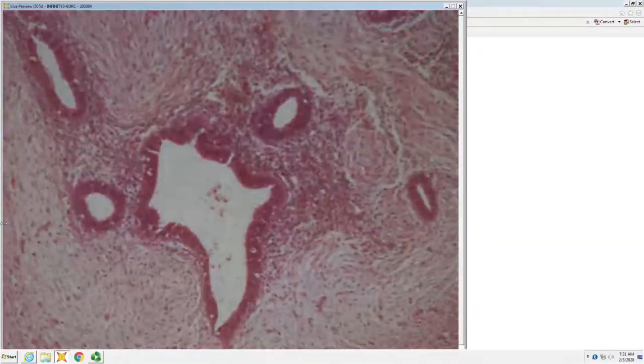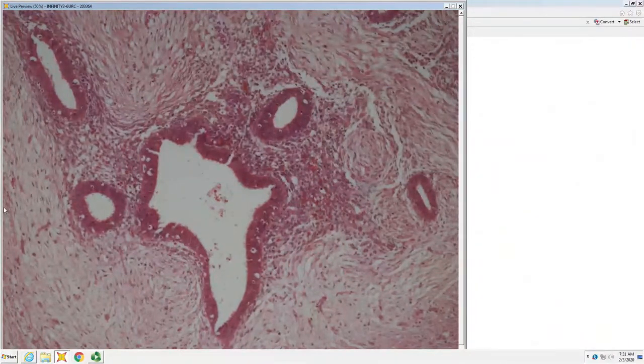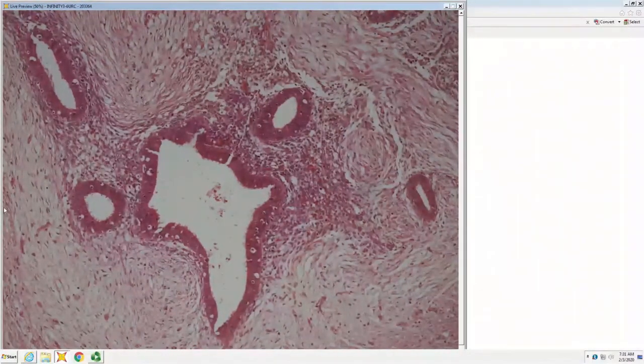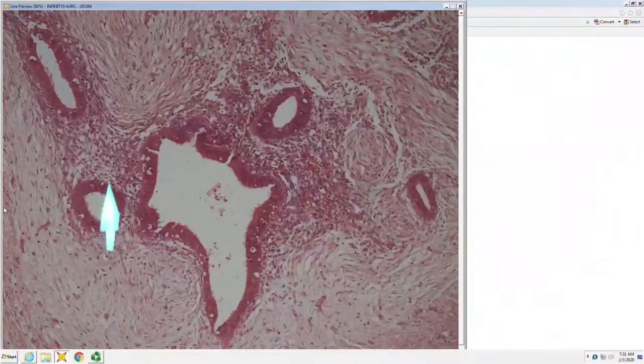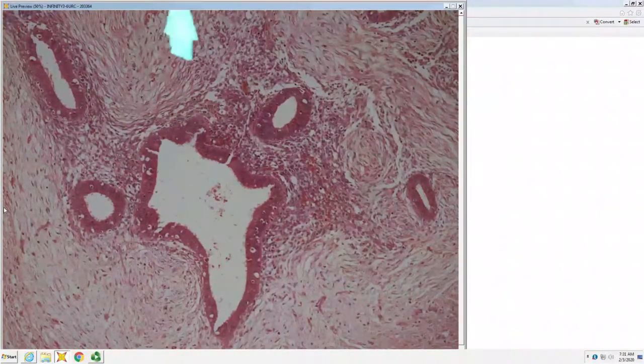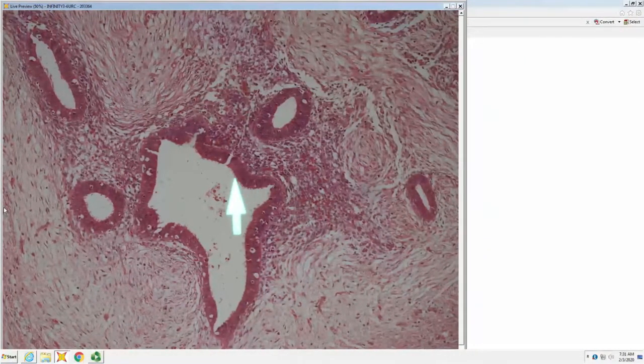Mark, what do you see here? I'm getting probably lymphatic. There's like a thickened wall, whatever we're looking at, with definitely some inflammation around it, some lymphocytes, some extravasated blood cells, so maybe it's vascular sites we're looking at. So not necessarily in the lymphatic. There's definitely stroma around it, fibromyxoid. There are plump mesenchymal cells in the stroma. There's red cell extravasation in the stroma. A columnar epithelium that looks secretory.